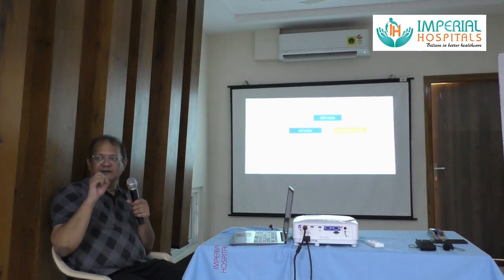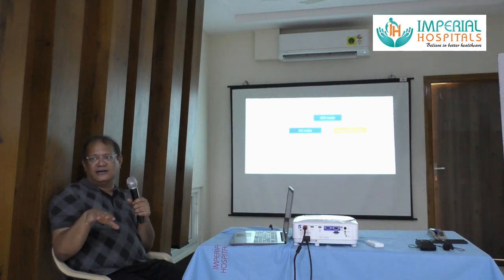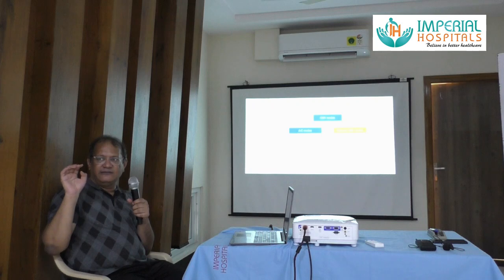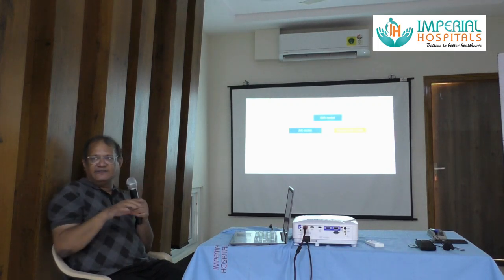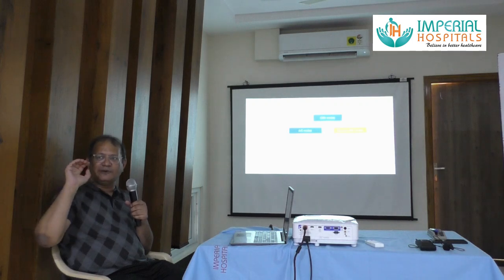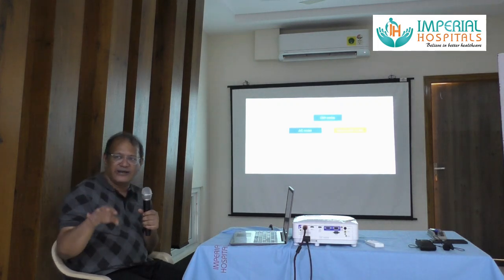The other way, the trigger can be from the patient. So the patient initiates a breath, and the moment the ventilator detects that a patient has initiated a breath, it will deliver the set tidal volume. In ACMV modes, the tidal volume that the ventilator will deliver when the trigger is the patient will be the tidal volume you have set. The change between SIMV and ACMV is that in SIMV, when the patient initiates a breath, the amount of breath that is delivered will be dependent on the patient. Like in SIMV, a certain amount of pressure will guide the air in. But in controlled mandatory ventilation, when the patient initiates the breath, in ACMV, the tidal volume you have set will be delivered.